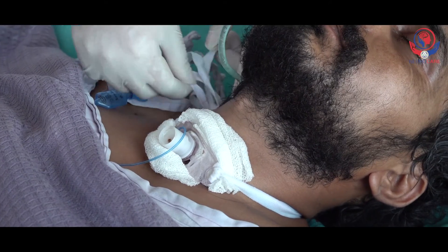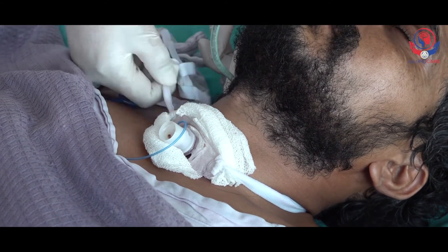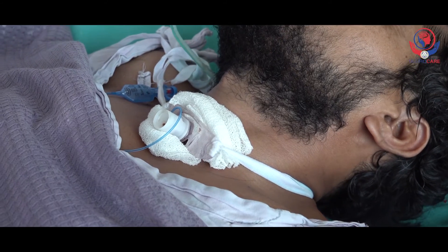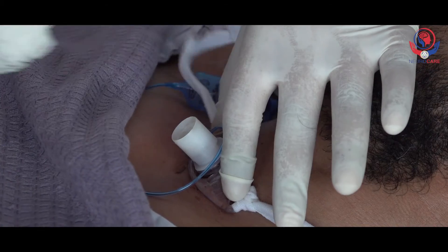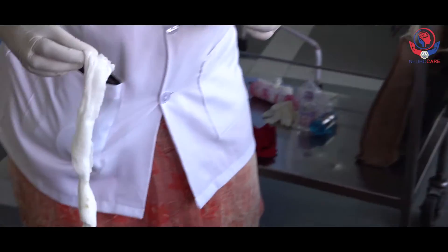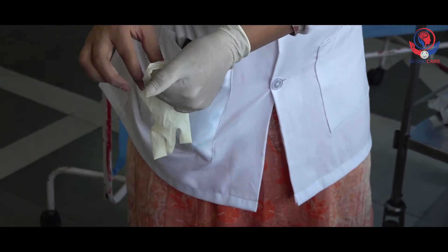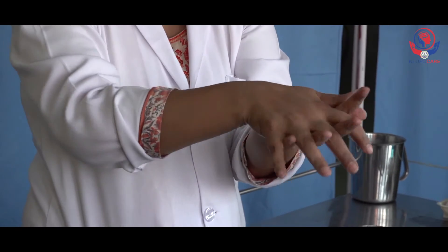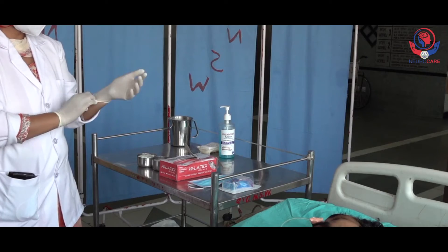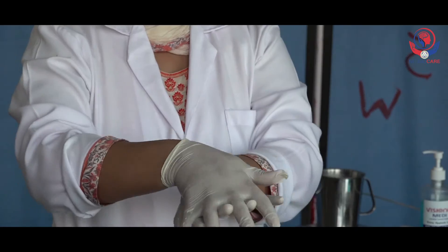Loosen the knot of the previous ties so that you can easily clean the stoma site and change the dressing of the tracheostomy tube. Remove the dressing around the tracheostomy tube with the dominant hand and discard it into the dustbin. Remove gloves and discard them in the dustbin. Again wash your hands with hand rub.